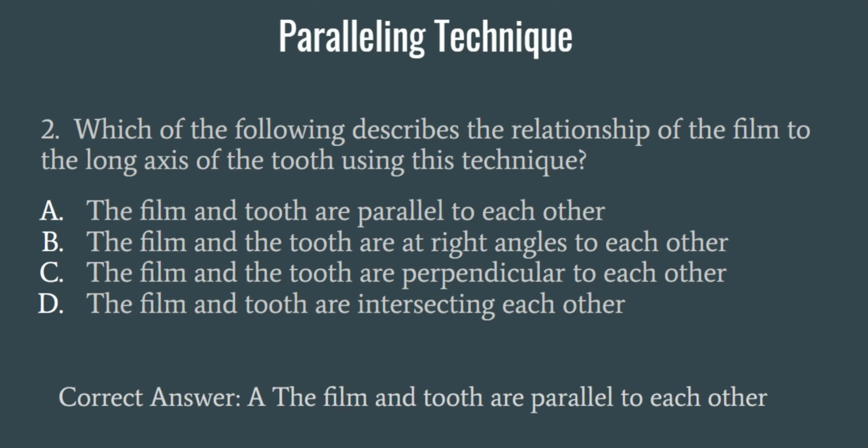The correct answer is A. The film and tooth are parallel to each other.